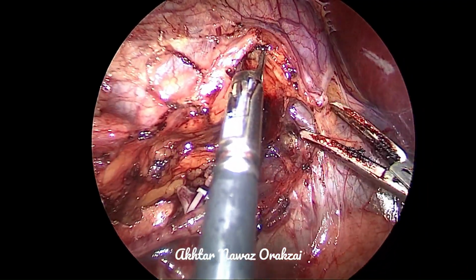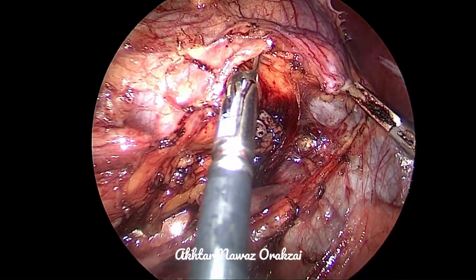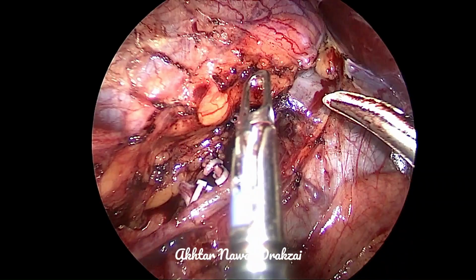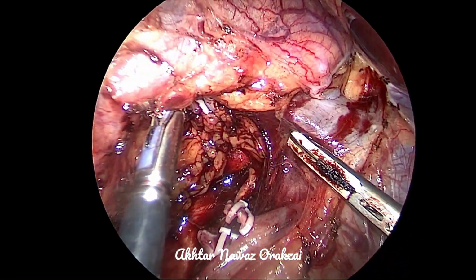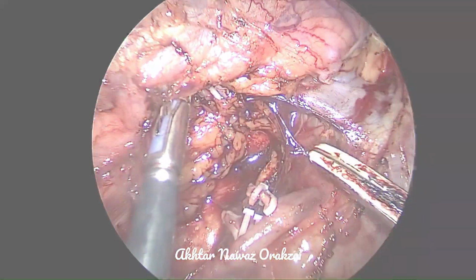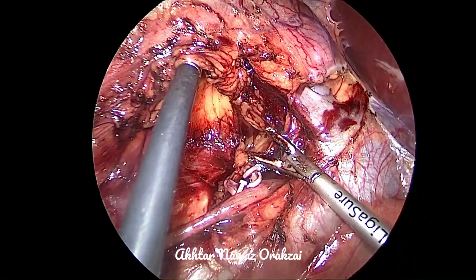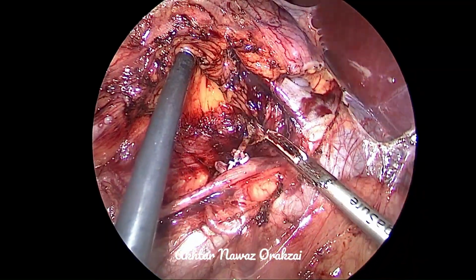and dissecting the peritoneum from the vein, we found out that there was another vein which was draining from the kidney into the IVC here, posterior to the main venous pedicle. So now we are trying to dissect this vein as well in order to reach the pedicle.